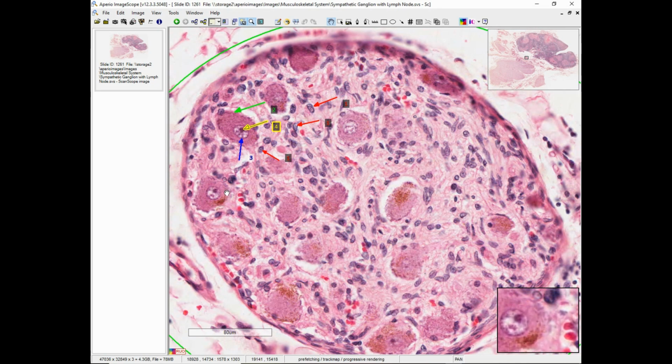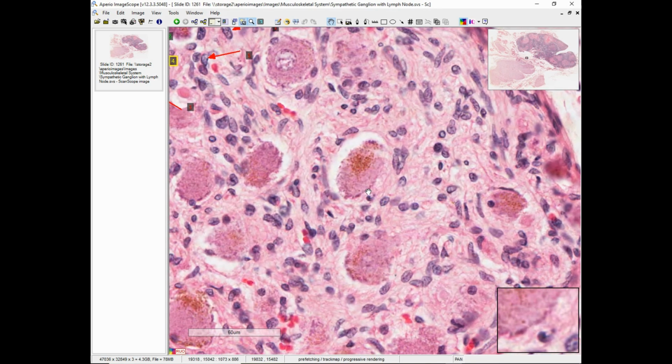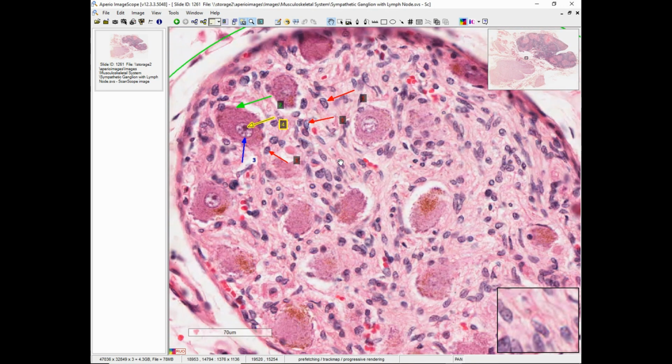We can see once again the nerve cell body, its soma. We've got some satellite cells around it, and the nucleus and nucleolus right there. One thing I want you to note here, that we can see a little more nicely than in some of the others up until now, is that many nerve cells accumulate these brownish little inclusions inside their cytoplasm as they age. This is called lipofuscin, and it's a very common thing to see. It's not necessarily pathologic, but because cells accumulate them as they age, they are associated with certain degenerative conditions, but possibly not in a causative way.